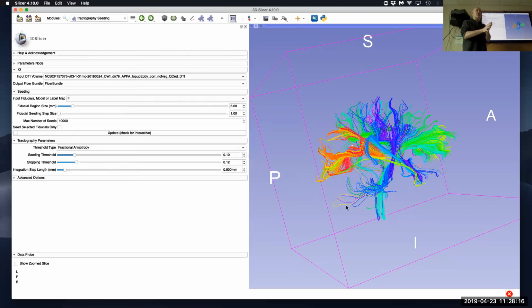If you get TIM Trio data from like 2010 to 2012, there was a lot of incorrect bad data that is not correctable because there was an interaction between the individual and its weight and the scanner that created a vibration. The vibration was at the frequency of the acquisition of the data, so there was an interaction between them.